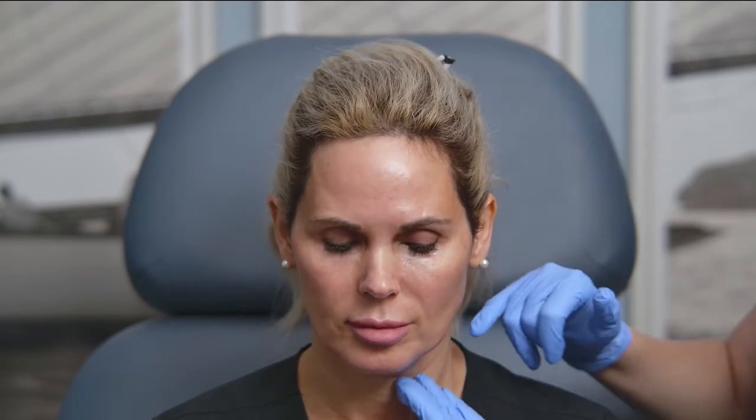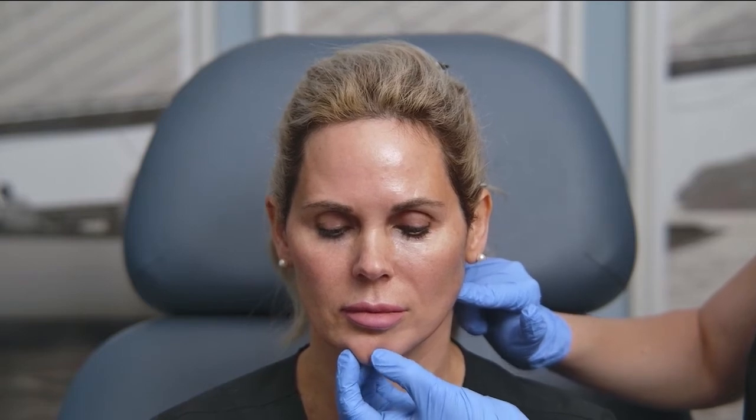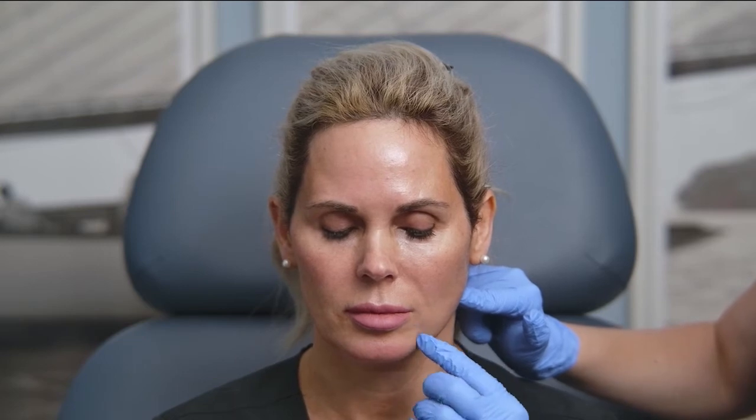Okay, so let's take a close look now at Stacy before we get started. Before I get going, I like to look at every angle and even have her tilt down for me. As we all know, gravity changes the way things look. So when her face is more downwards, she does have more jowling, versus when her face is more up, it's more taut. So go ahead and look down again. By restoring that volume loss, we're going to hopefully help keep her lifted as she's looking down. Again, restore this projection in her chin, and then even help with this little marionette line that's beginning to form here by restoring this volume loss along the bone here.